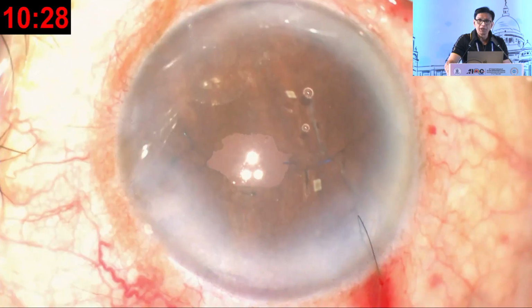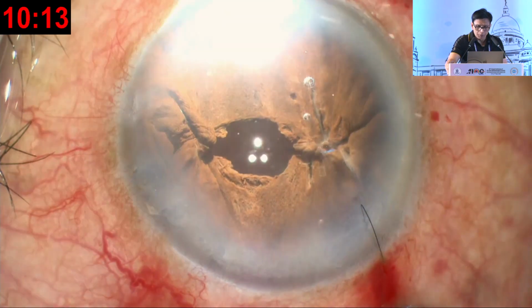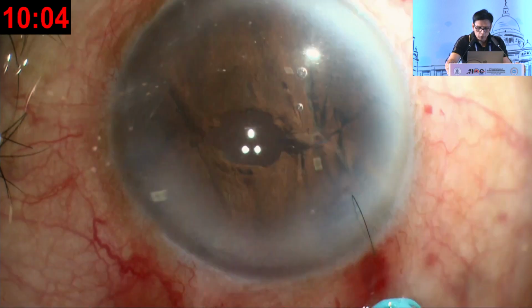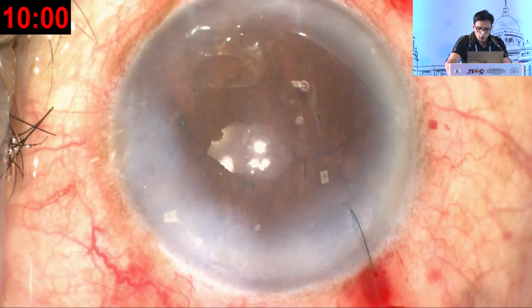And now you'll see that pupil there. See the Purkinje image. All of you, when you go back, focus on your Purkinje image. This is erect. If you see an inverted Purkinje image, that is P4, the fourth Purkinje image. Don't concentrate on that. This is the one you've got to look at. This is without the microscope light, using an endoilluminator light only. See how it looks. Nice clean thing where you're seeing the whole eye without the microscope light on. And that's the Purkinje image. Take out the trocar. Now close up the eye.